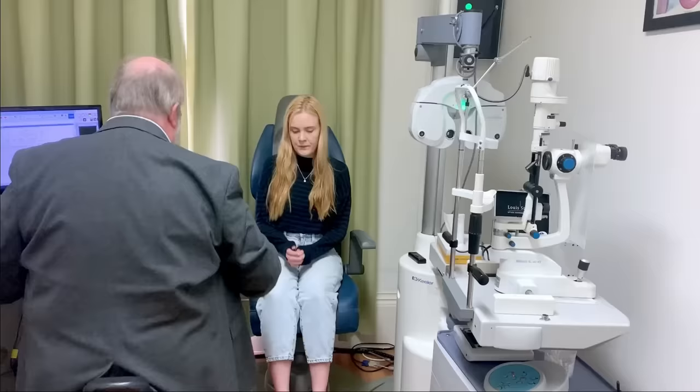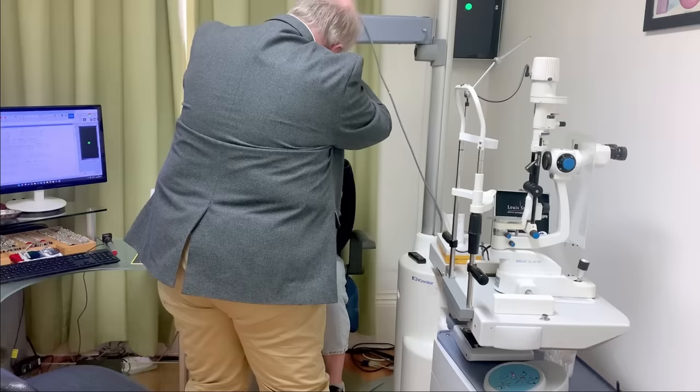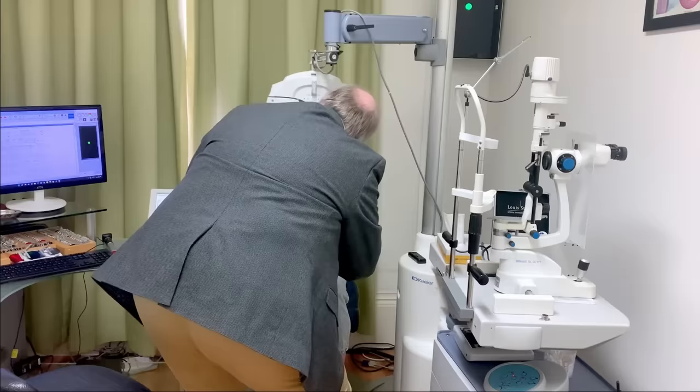Start off and have a little look and see what's going on. So I'm going to pop this onto your... I'll just clean this beforehand, okay? So I'm going to pop your forehead on here and then we're going to look through the little eyeglasses, okay? So I'm going to pop that in there. So if you lean forward against it, that's lovely. Is that all right there for you? Yeah. Can we see you? Nearly. Let me take you up just a little bit. There we go. That better? Yes, we can see you now, can't we?